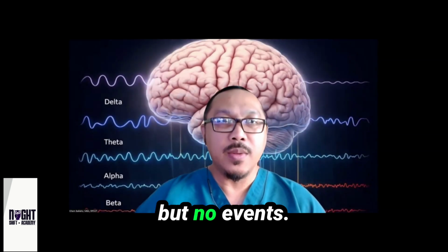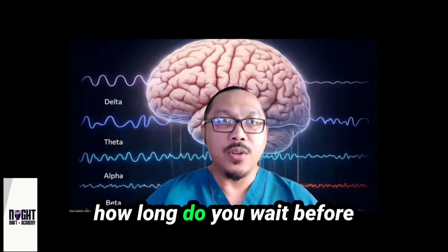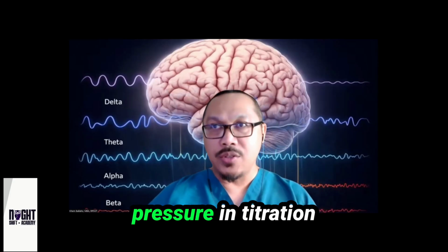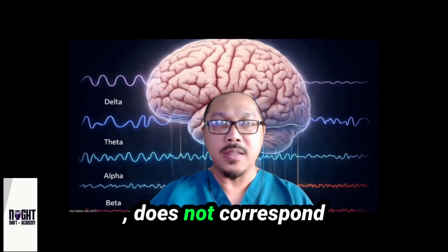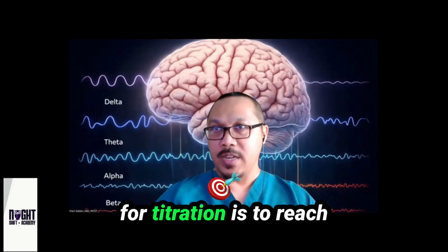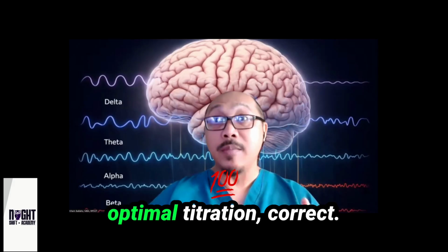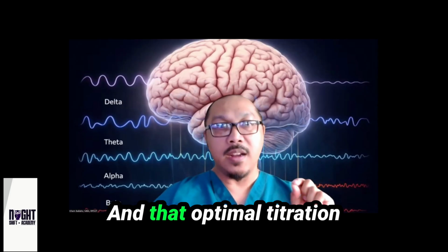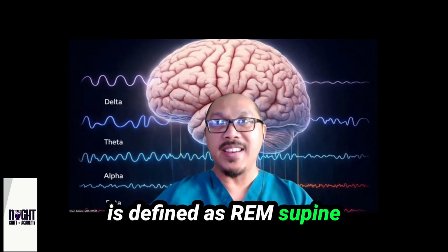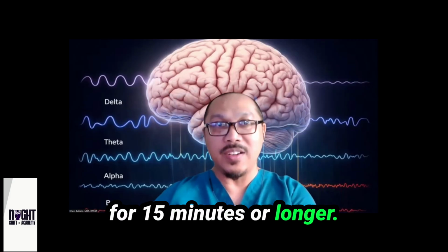During titration, 6 centimeters, but no events and no REM. How long do you wait before you increase pressure? So increasing pressure in titration does not correspond to a sleep stage, even though the goal for titration is to reach optimal titration, correct? And that optimal titration is defined as REM supine for 15 minutes or longer.